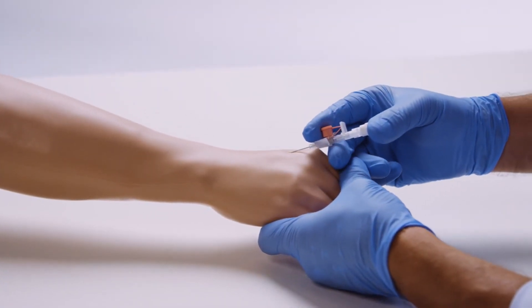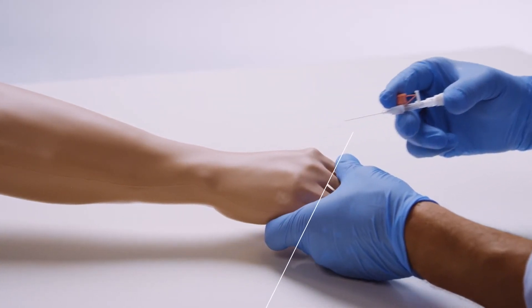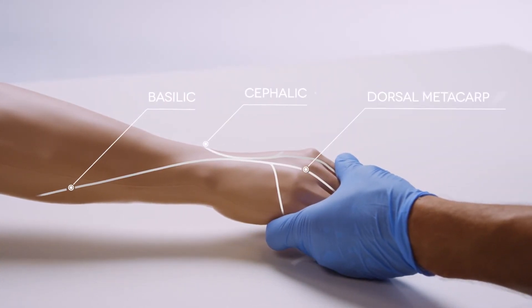For practice in IV cannulation and infusion, a needle can be inserted into the dorsal metacarpal veins of the hand, or the basilic or cephalic veins.